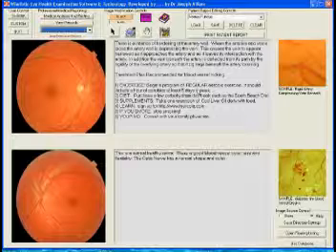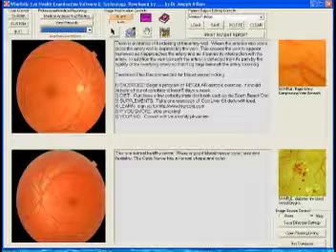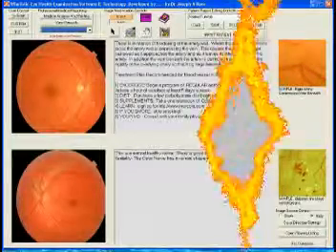After we started using the program, people were so enthusiastic, they were pouring through the door, and we charged a nominal fee of $35, and in 6 months we paid off the retinal camera, and ever since then this has made us a very nice profit and helped build our practice. We're talking $50,000 per lane with no real effort. Think about that. Provide the best of care for your patients. Have a tool that will report to the doctors in the community the kind of work you're doing. It'll market you to your patients. Your patients will market you to their friends. And it's all because you're providing great care with simple office tools in your office and doing it profitably.